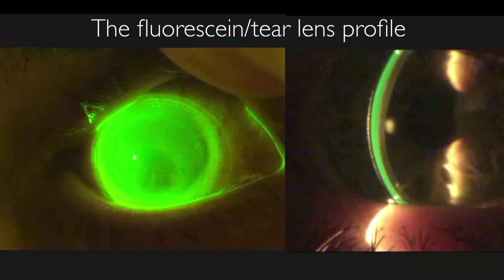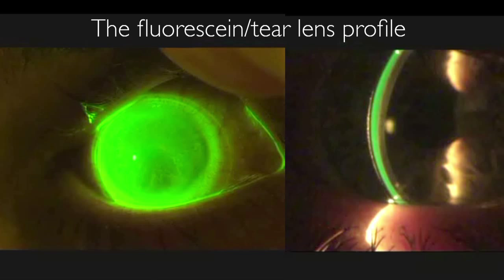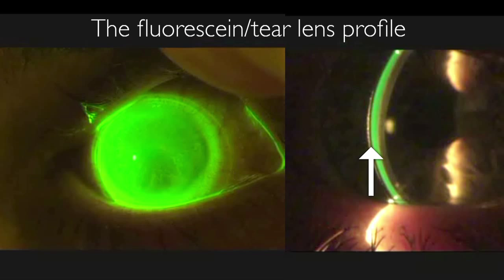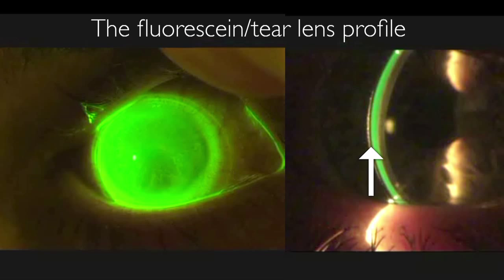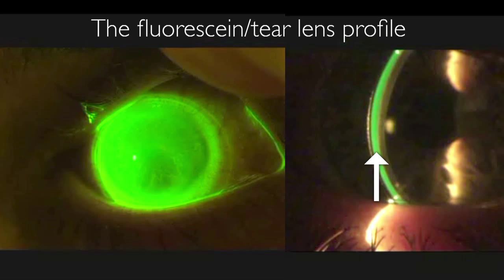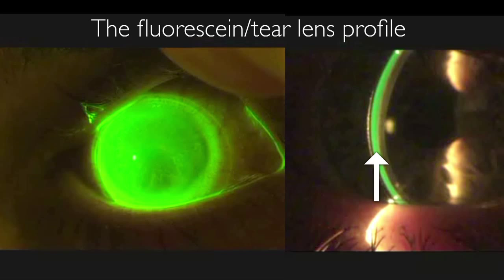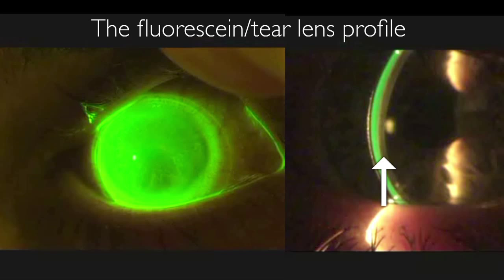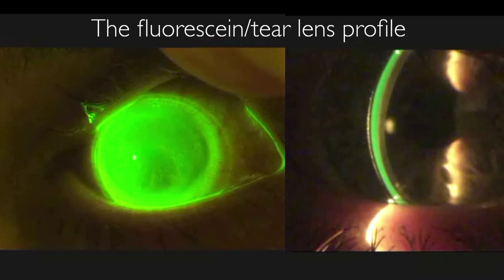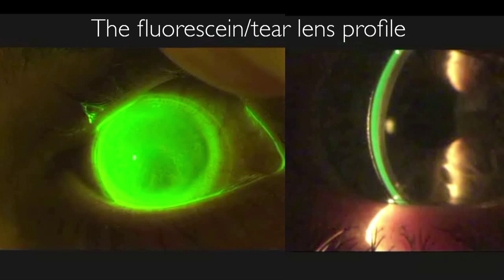As we look at this eye with an optic section, we want to maintain a very sharp focus. Looking carefully at the furthest left, you'll see the light shining off the front surface of the lens. Underneath that is a very thin black ribbon of plastic — the material of the lens. Then you have the green zone that's the fluorescein within the tears, and behind that the grayish zone is your actual cornea. Looking at the left fluorescein pattern, we see a fully vaulted eye but have no idea how far away the lens is from the cornea.